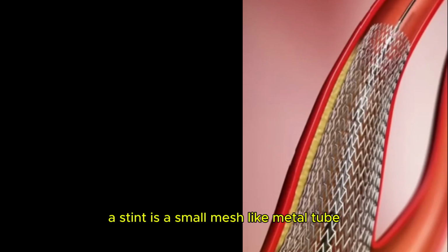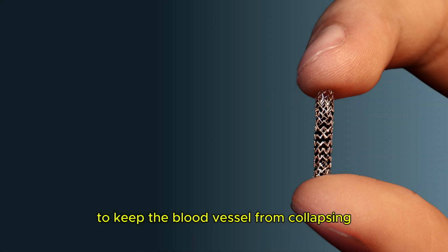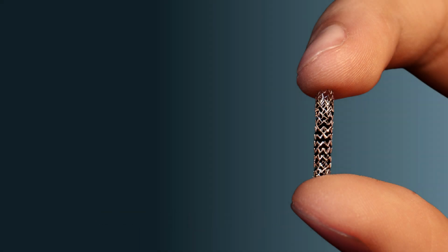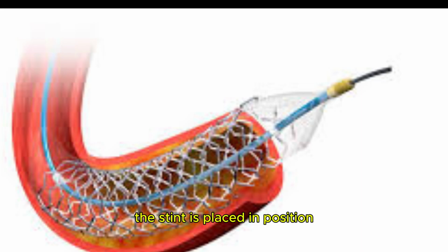A stent is a small, mesh-like metal tube designed to hold the artery open permanently. It acts as a scaffold to keep the blood vessel from collapsing after the balloon deflates. Some stents are coated with medication to prevent re-narrowing of the artery. After the artery is widened, the stent is placed in position. The balloon is inflated again, expanding the stent and locking it into the artery walls.